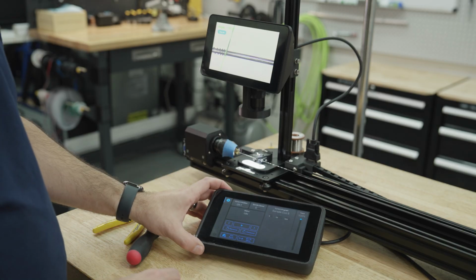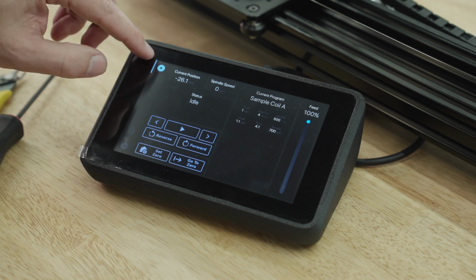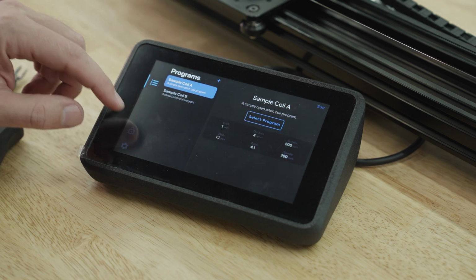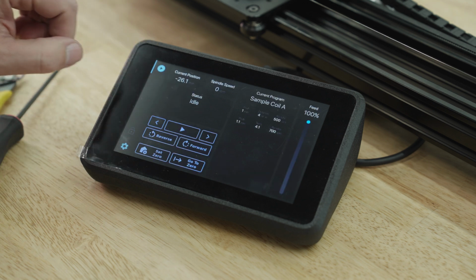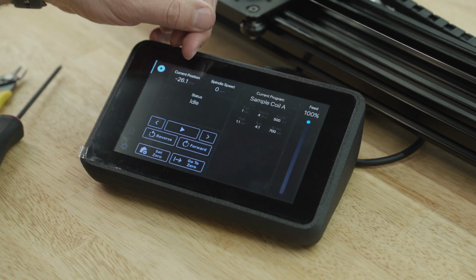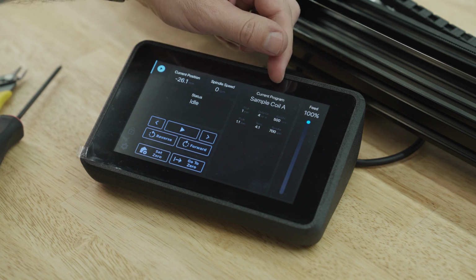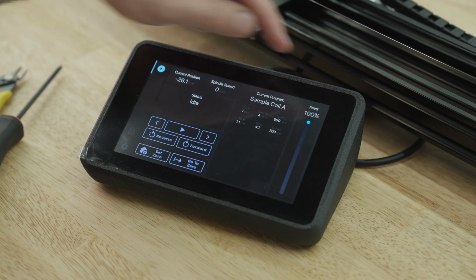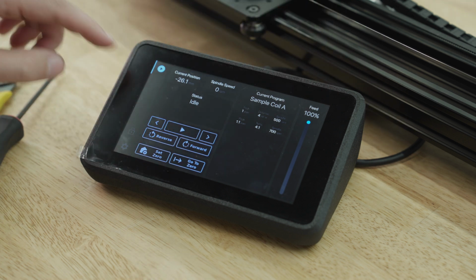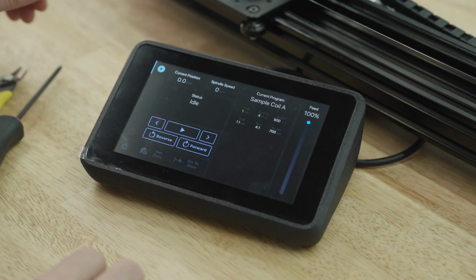Next, I want to focus your attention to the console. There are 4 tabs on the left of the screen: Main Screen, Program Screen, Lock Screen, and Settings Screen. Let's start on the main screen. It displays the carriage current position, current spindle speed, current program and its steps, real-time feed rate override, various jog buttons, set 0 and go to 0. Now let's go to the program screen.